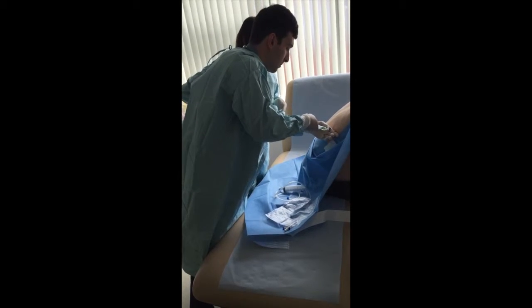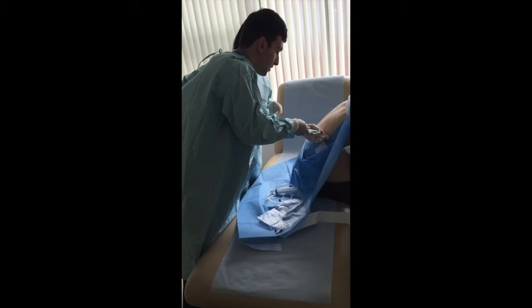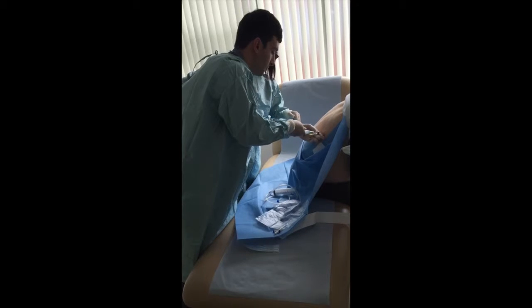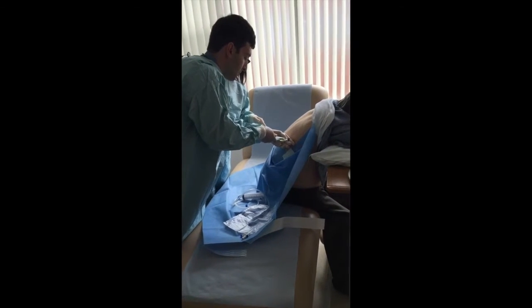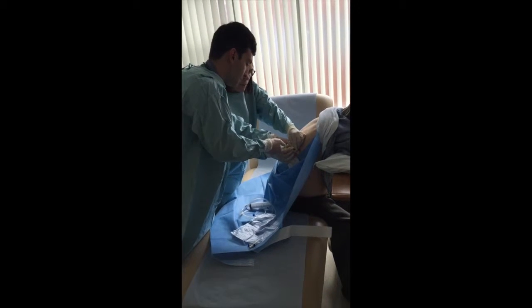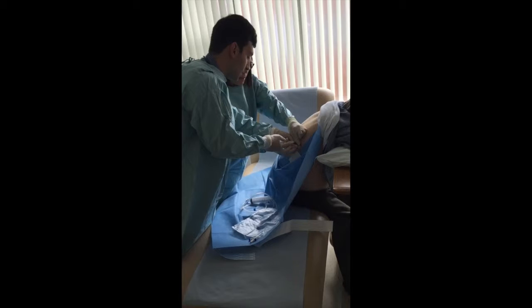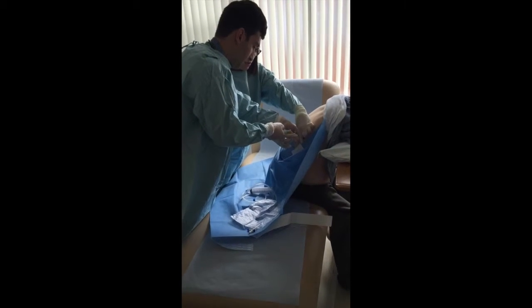Okay, so aspirating as you go. Keep going, aspirate. You get your fluid, so just go slightly a little bit further in just to get through into the pleura. Get a good glug of fluid. Happy? And then what you're going to do at this point is start pulling back the needle and inserting the cannula right to the hilt. And that just goes straight in.